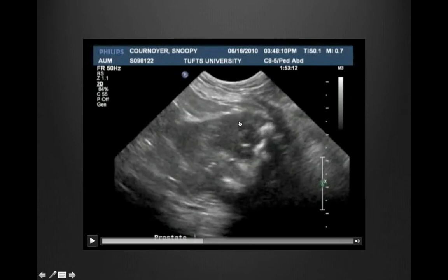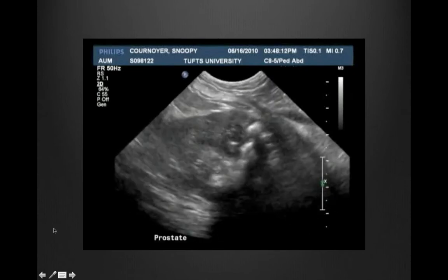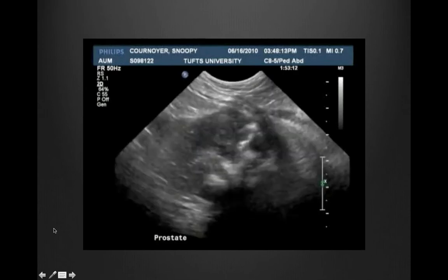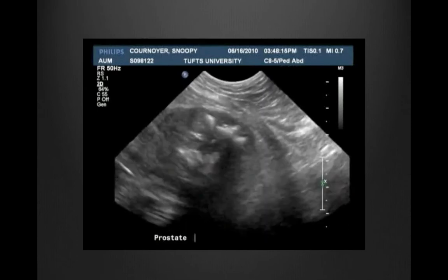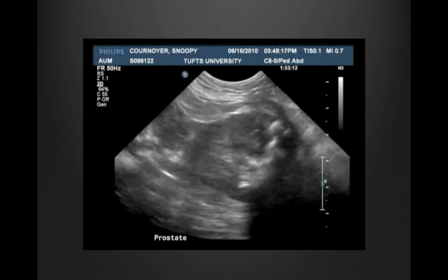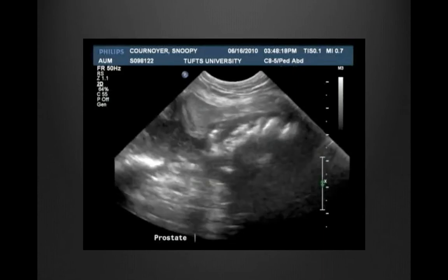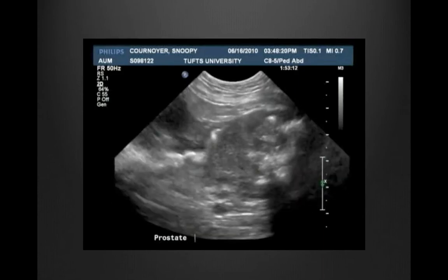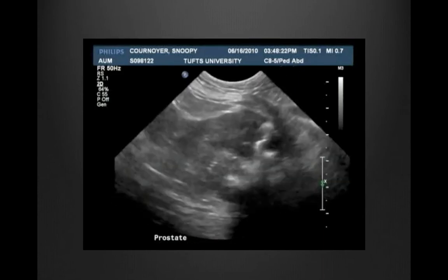We're seeing this heterogeneous prostate — large, heterogeneous, caudal to the urinary bladder — with multiple hyperechoic foci and distal shadowing. This is very concerning for prostatic neoplasia with mineralization within it.